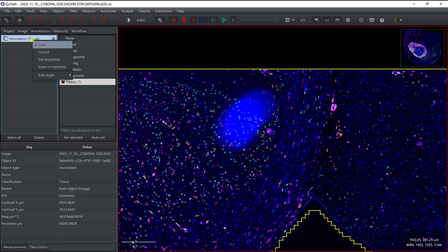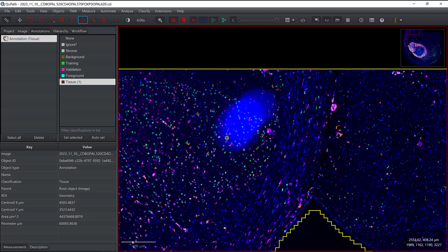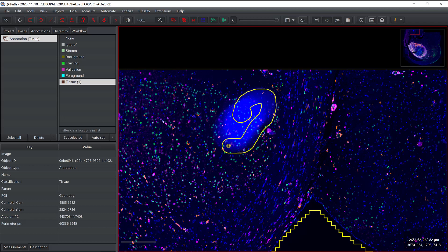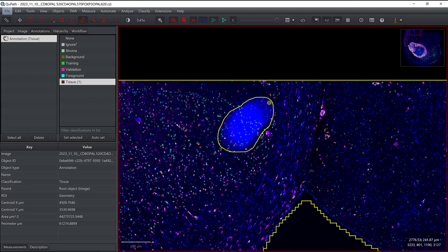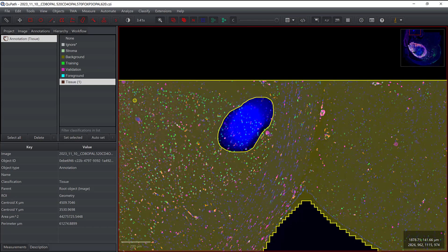To modify the annotation I first need to unlock it. Once unlocked I can use either the brush or the magic wand — I'll use the brush here. The brush size depends on the current resolution. I can use the Alt key to alter the annotation and draw to remove the unwanted part. Using Shift+F again I can see which regions are part of the annotation.